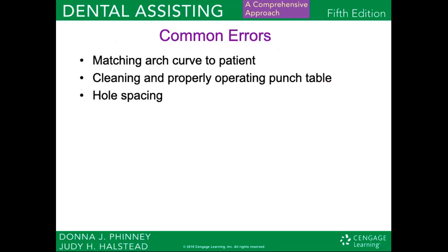So some common errors in preparing or placing these dental dams are matching the arch curve to the patient, cleaning and properly operating the punch table, and then spacing the holes correctly. So in lab, we will go over some of these common errors and how to go around them so that they aren't made in real life.